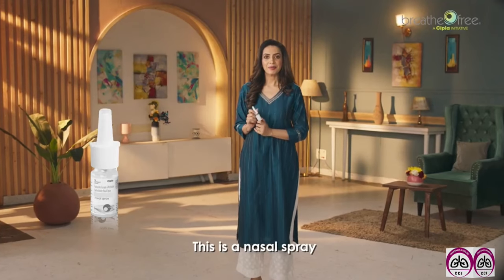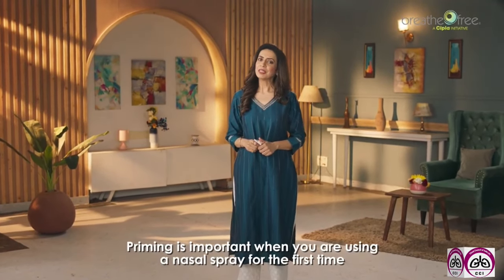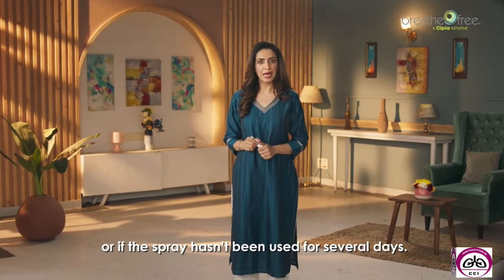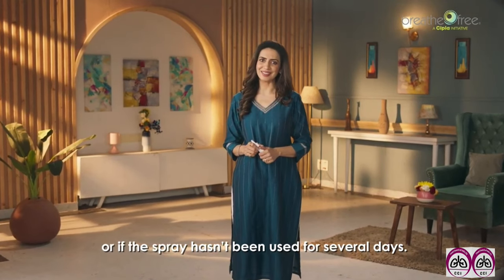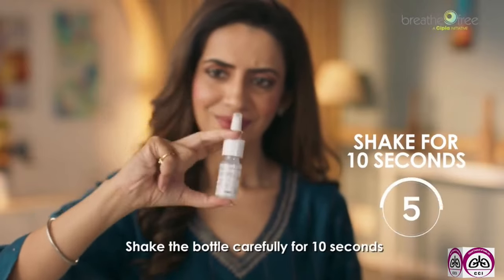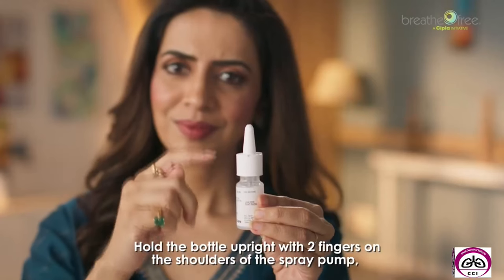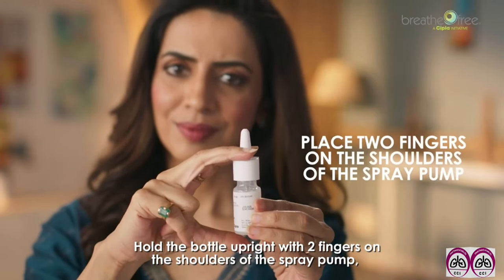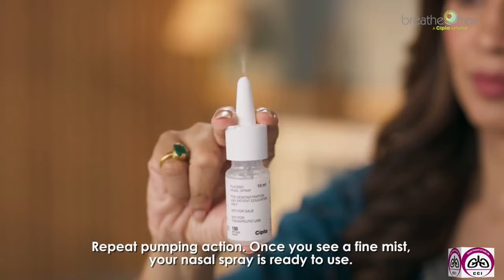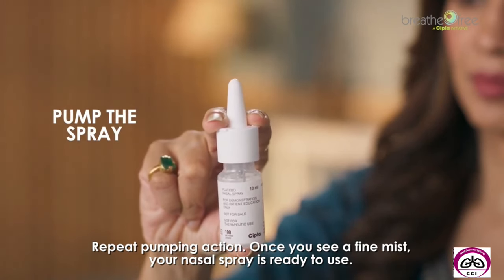This is a nasal spray. Today I'm going to tell you how to use it correctly. Priming is important when you're using a nasal spray for the first time or if the spray hasn't been used for several days. How do you prime a nasal spray? Shake the bottle gently for 10 seconds, remove the dust cap from the spray, hold the bottle upright with two fingers on the shoulders of the spray pump and your thumb on the bottom of the bottle. Repeat the pumping action. Once you see a fine mist, your nasal spray is ready to use.